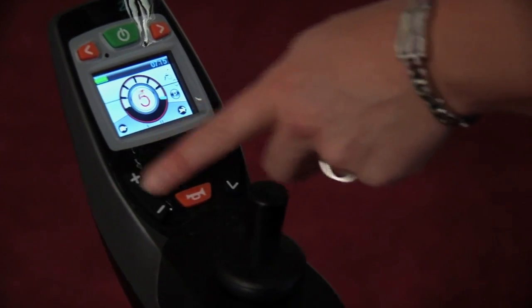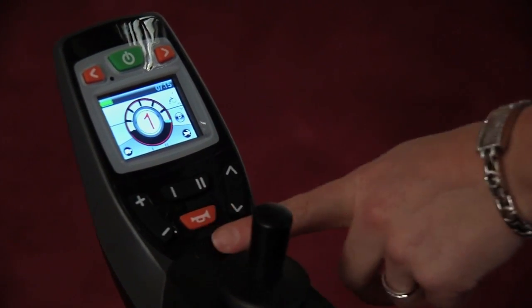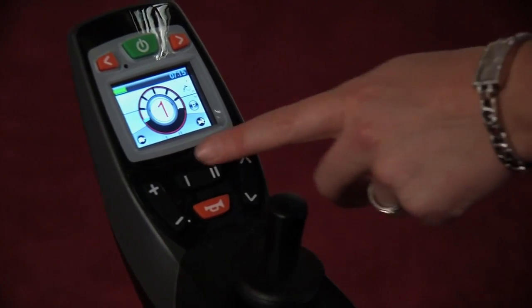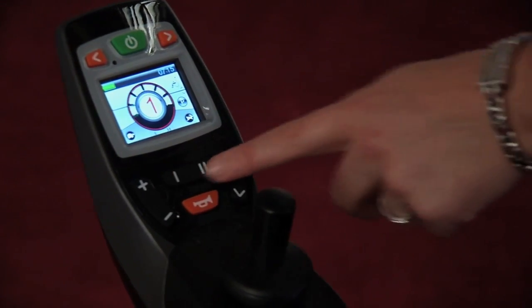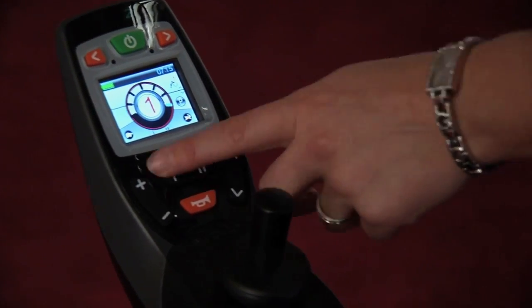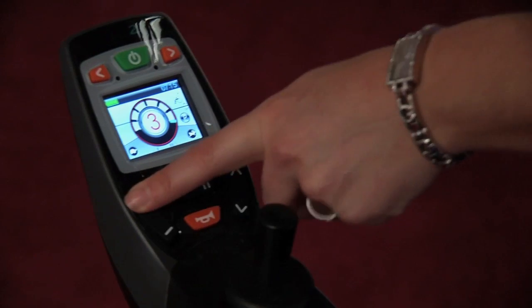Has 5 different speeds. One of the neat things is, because it does go so fast, when you're first beginning to use it, you can actually scroll within a speed based on the little hash mark. So you can start out very, very slow, which, like I said, is very, very good for those maybe who have not used a power chair before. So you can scroll through all the speeds.